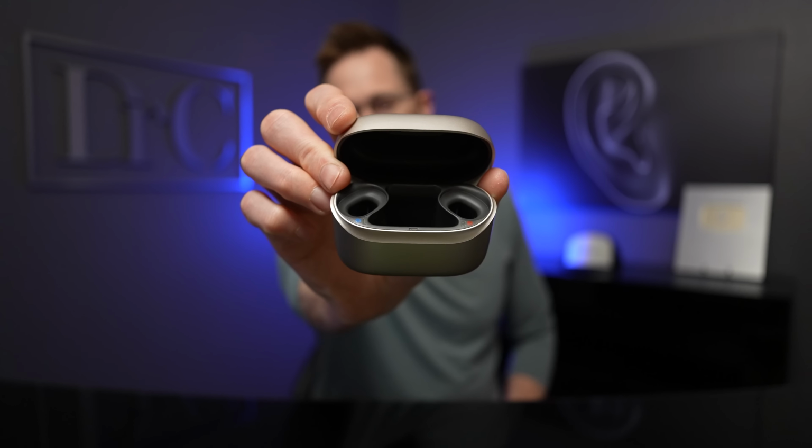My issue with the charger has to do, once again, with the size of the well in the center where your custom ear molds would go into. Because any custom ear mold, if you use a canal lock or a skeleton lock, heaven forbid, there is no way that that's going to fit nicely inside of there. It's not really going to be an issue for someone who uses rubber domes on the ends of their receiver wires, but if you use a custom ear mold, or rather need a custom ear mold, you may not be able to use these hearing aids.